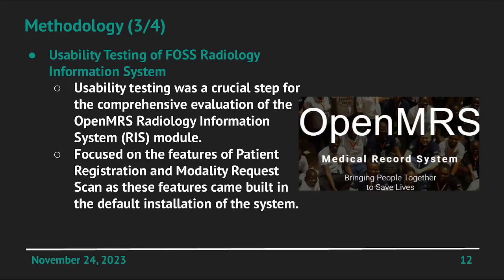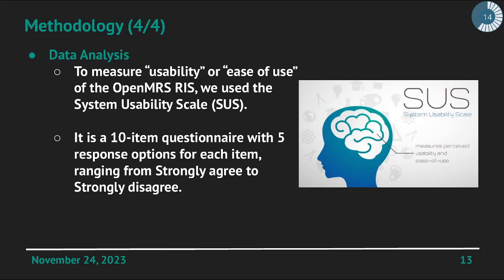Upon discovery of a free and open source radiology information system, usability testing was carried out. And this was a crucial step for our comprehensive evaluation of the OpenMRS radiology information system module. We focused on two main features, which are patient registration and modality request scan, as these features came built in the default installation of the system.